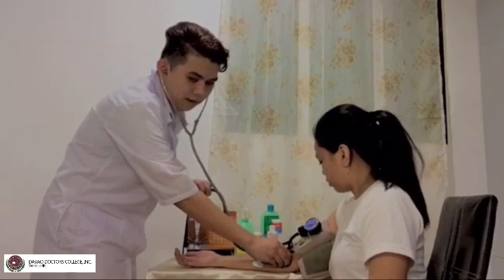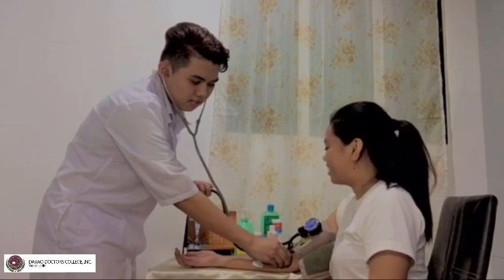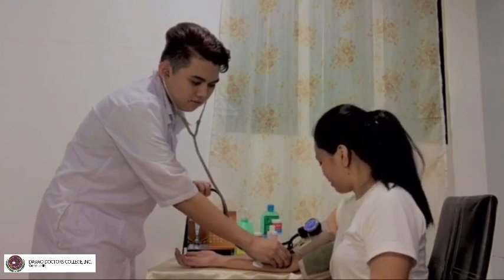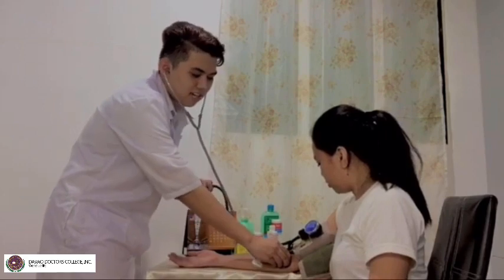Sa'yo mo na feel, ma'am? Okay lang. Sige.